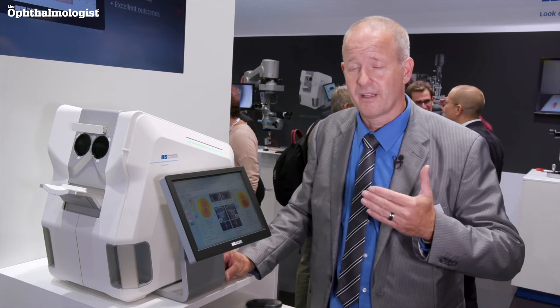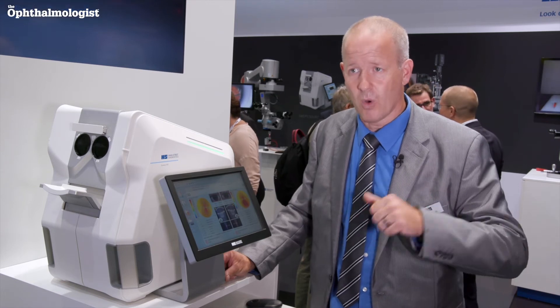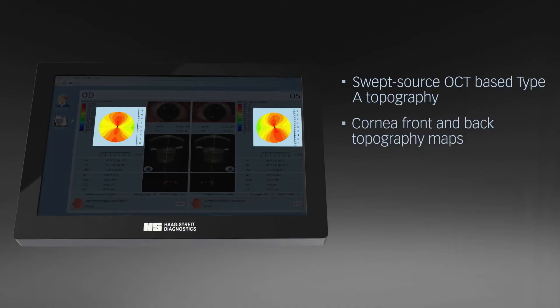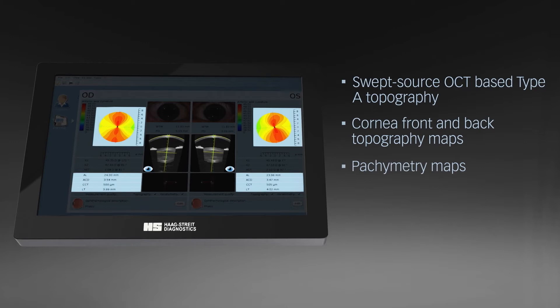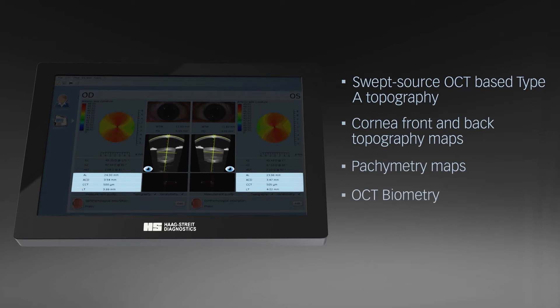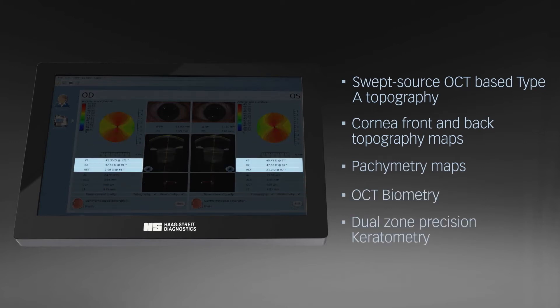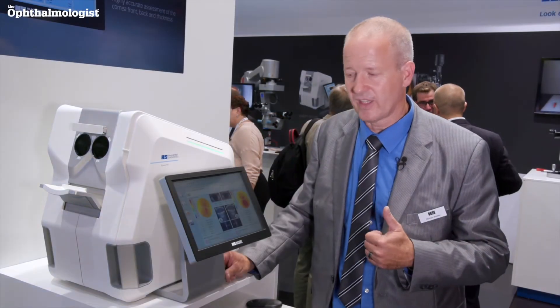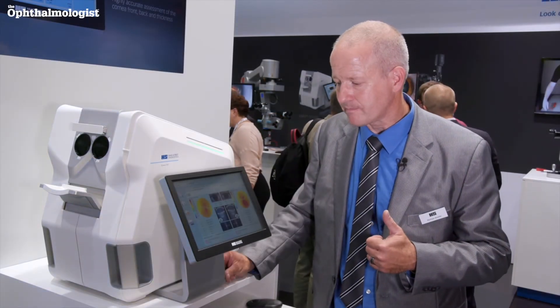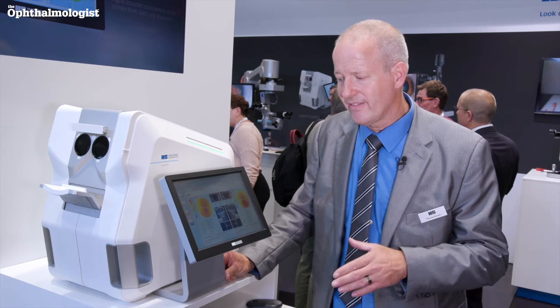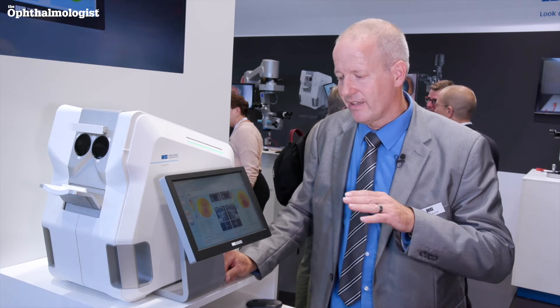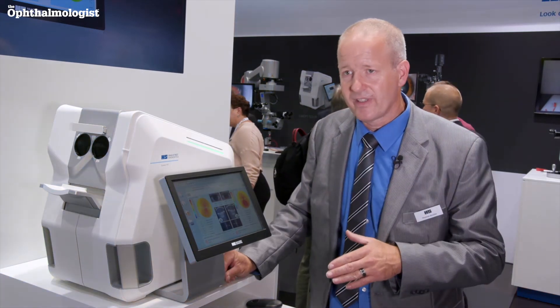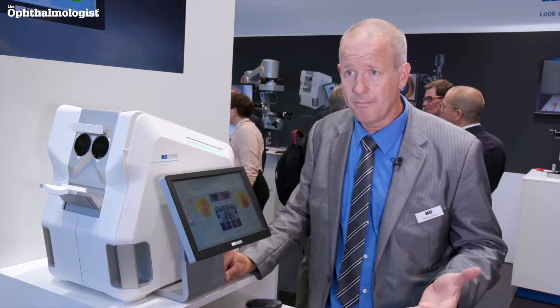It's a combination: you get all the results in one measurement — topography, keratometry, axial length — and you can also document anomalies with OCT cross-sectional images, all in one single fully automated device. In a network environment, it even allows you to review data from home.